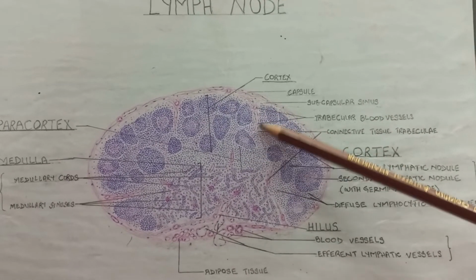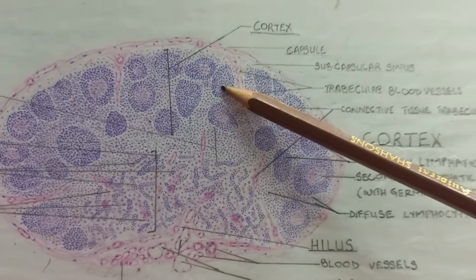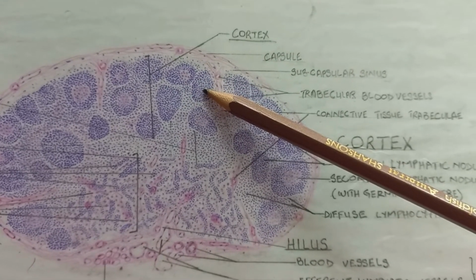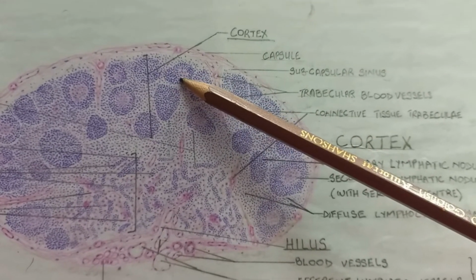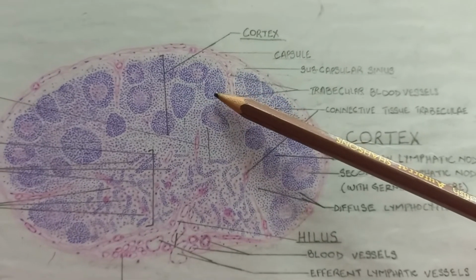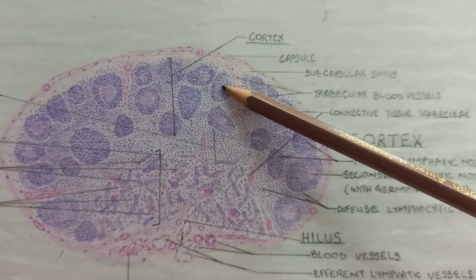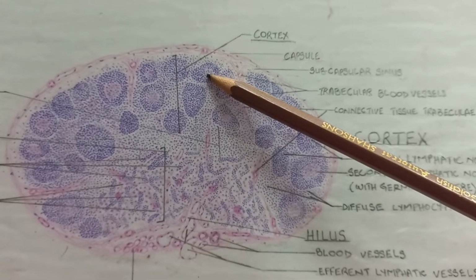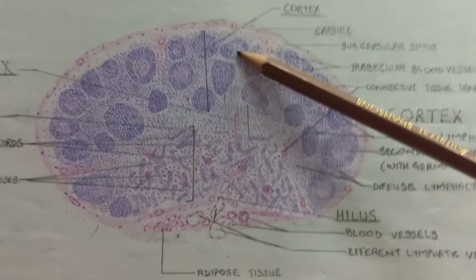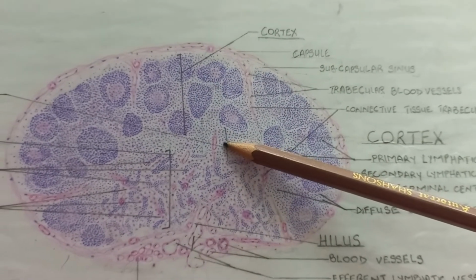So this superficial or nodular cortex, as you can see, has the lymphatic nodules. Here you can appreciate two types of nodules. These are the primary lymphatic nodules and these are the secondary lymphatic nodules. What is the difference between these two nodules? As you can see, in the primary lymphatic nodules, there is no germinal center. But in the secondary lymphatic nodule, there is a light staining area in the center, which is known as the germinal center.